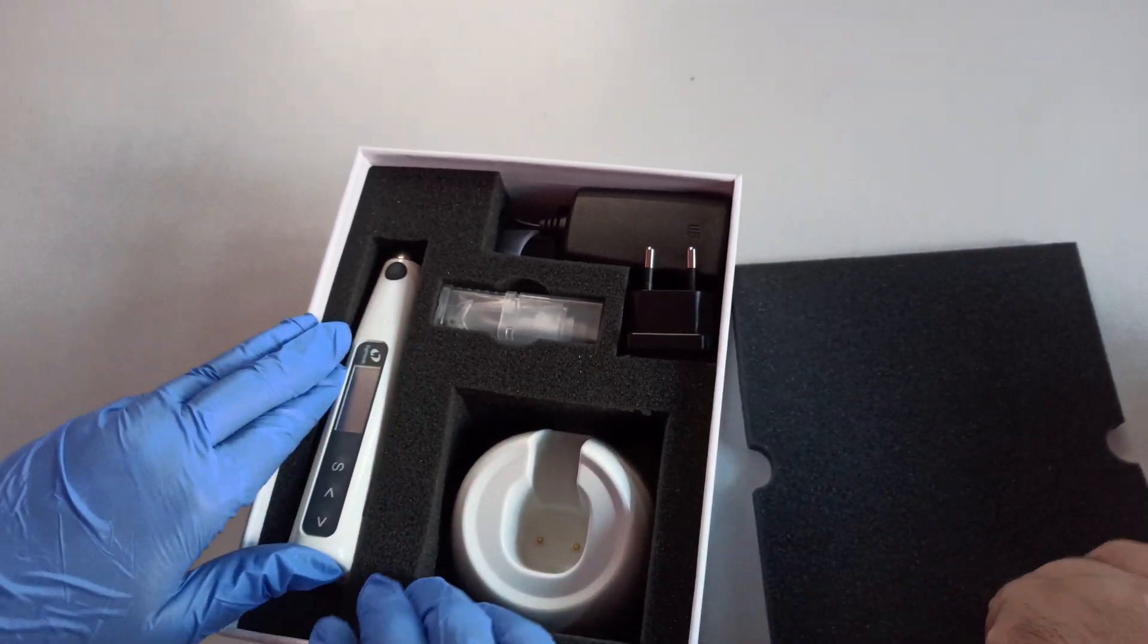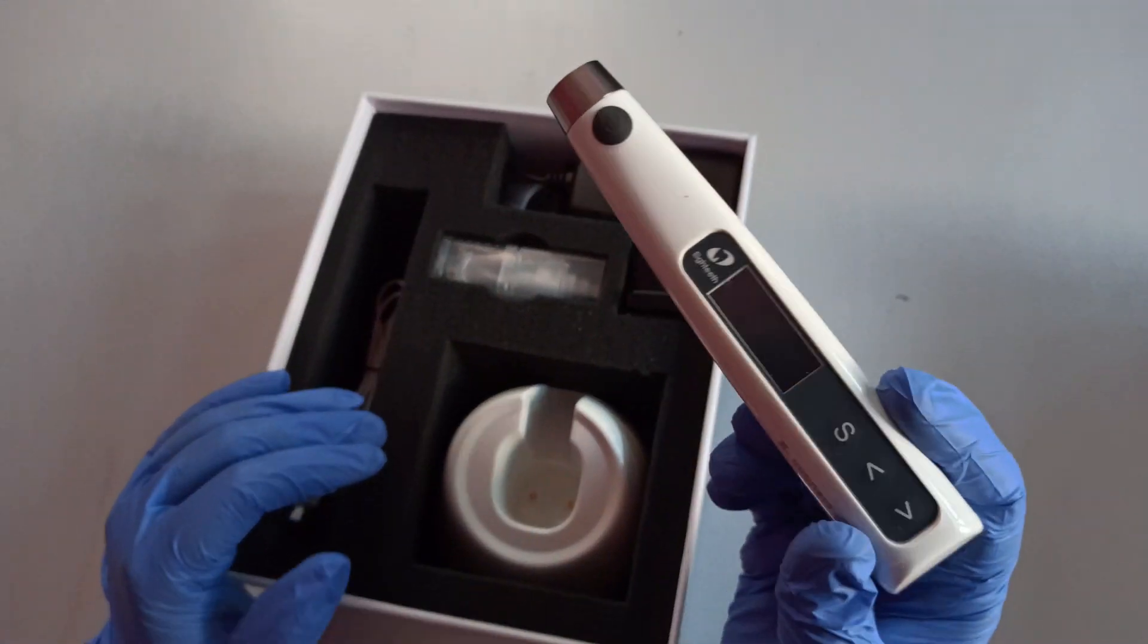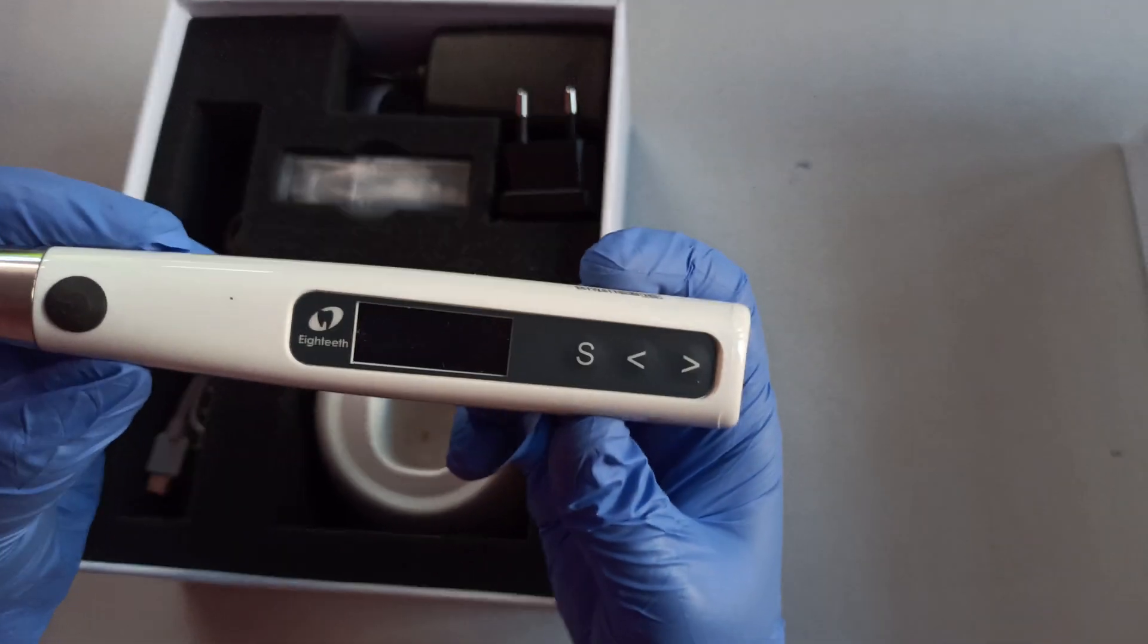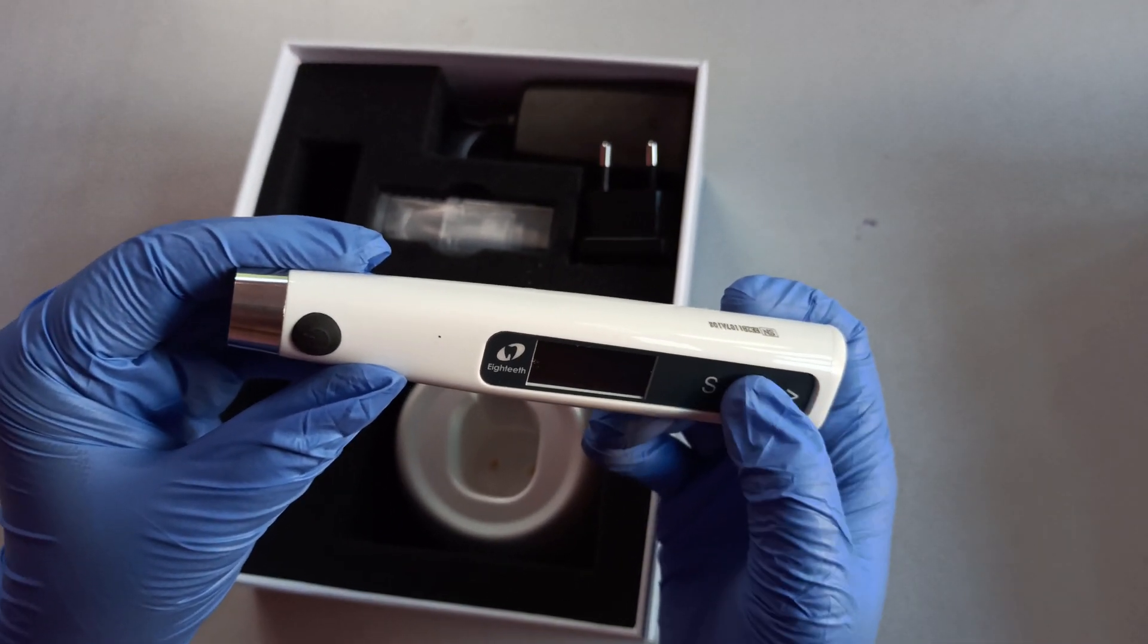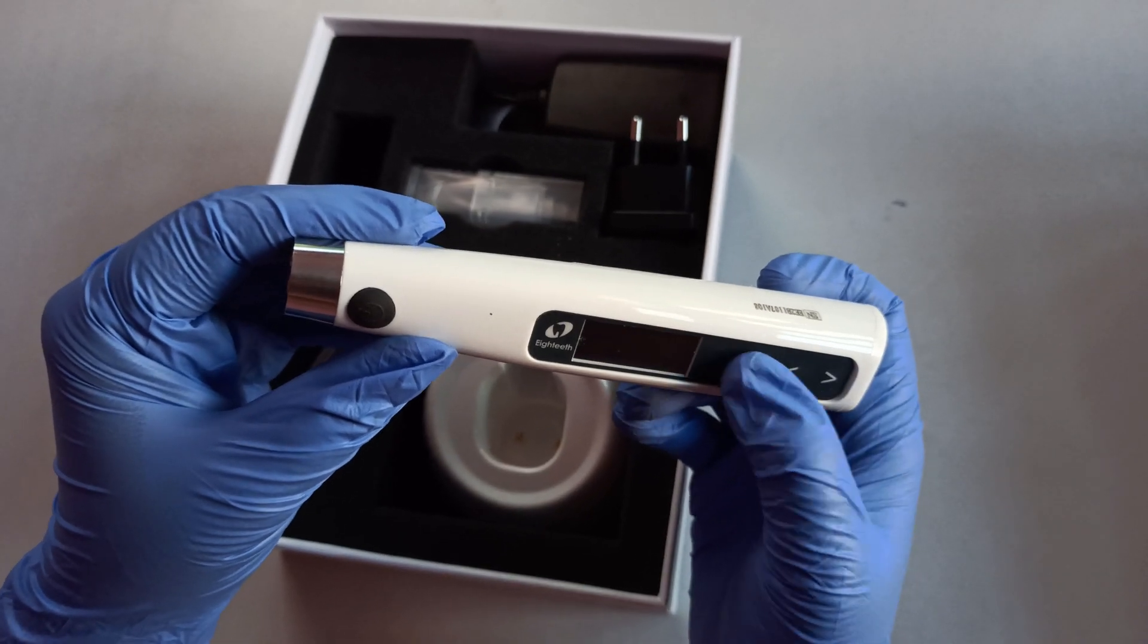Let's look at the parts of the motor. The first part is the motor handpiece. In this, you will find four buttons: the power button, system button, and up and down arrow buttons for changing the features.